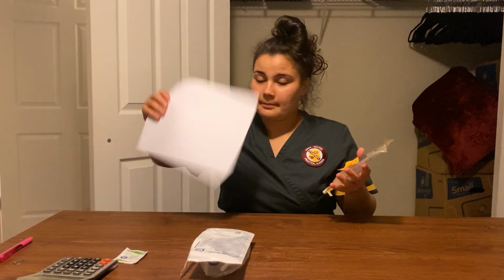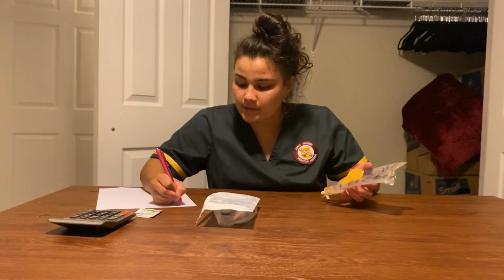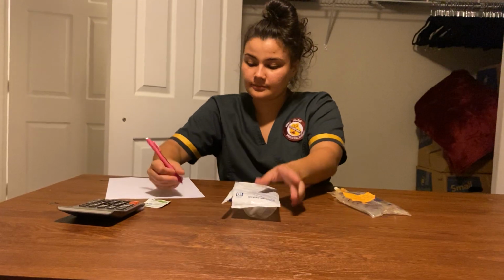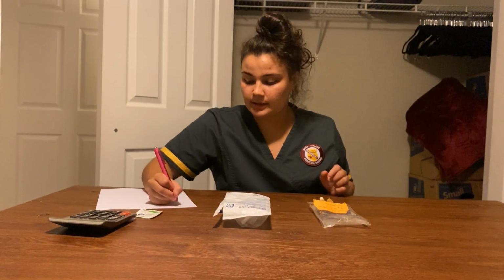So after I gather my equipment, I need to then calculate my drops per minute. I have 125 milliliters. So what I'm going to do is 125 milliliters times my drop factor, which is 10. And this says infuse over 1 hour. So we're going to do 60 minutes.